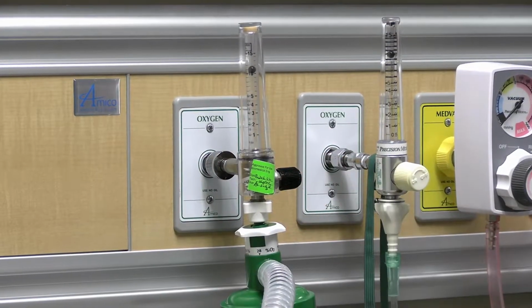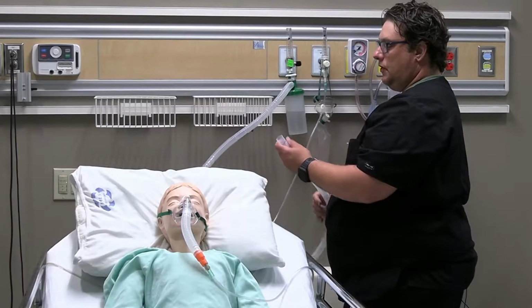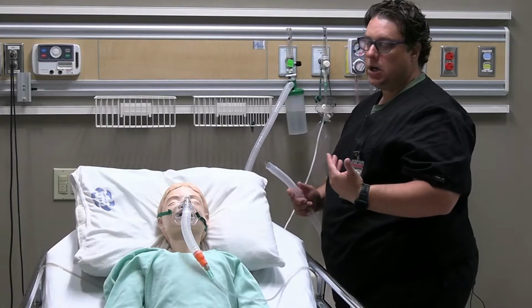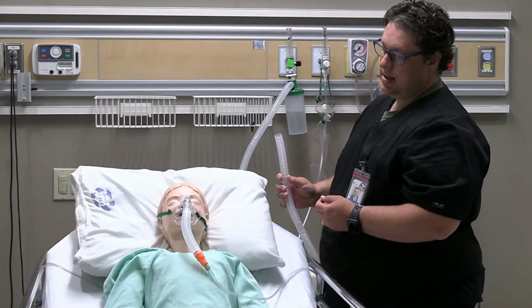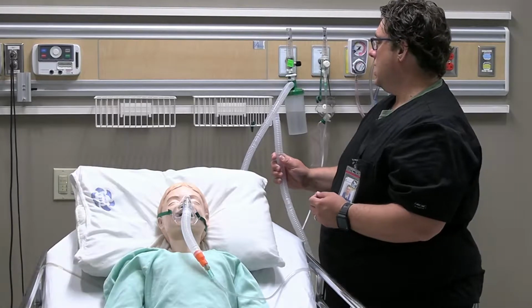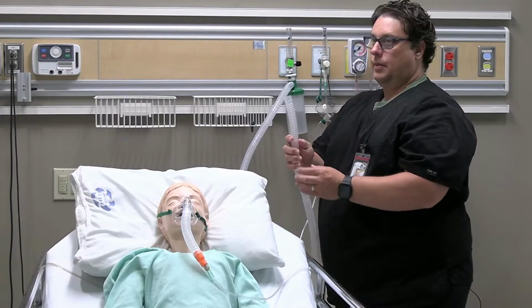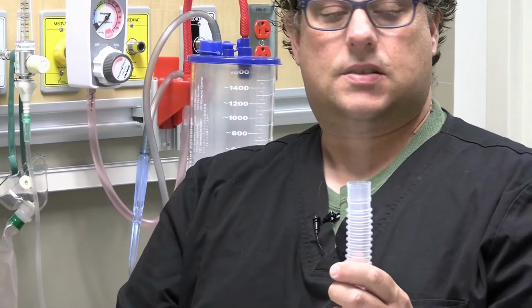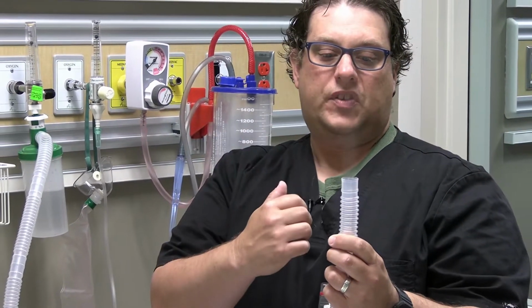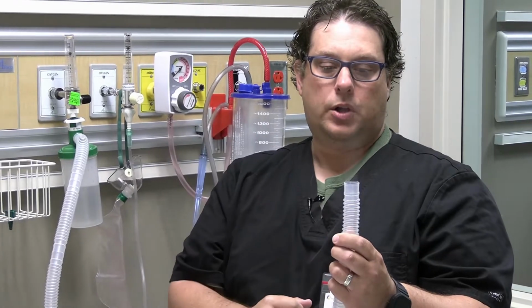liters. And again, the one thing that's a downfall to this is it is a bit louder for the patient. So the patient's environment will be a bit noisier. And a good thing to check for, and I'm not sure if you can see that, is the mist coming out of the corrugated tubing there. So that is 50% oxygen with the cool mist humidity. So you can see that there.